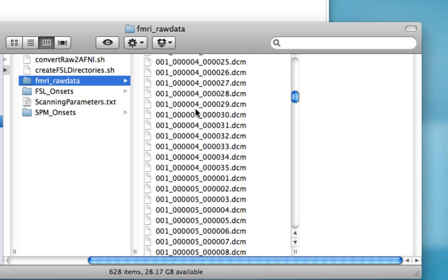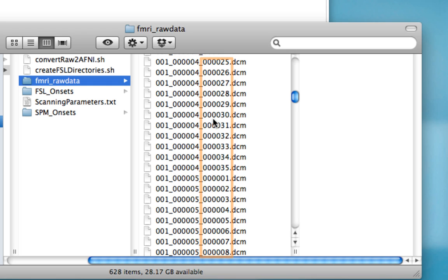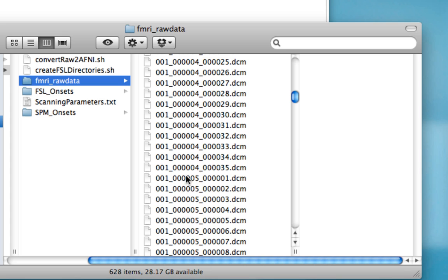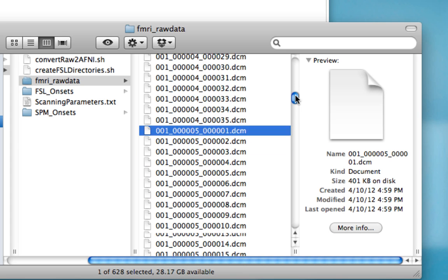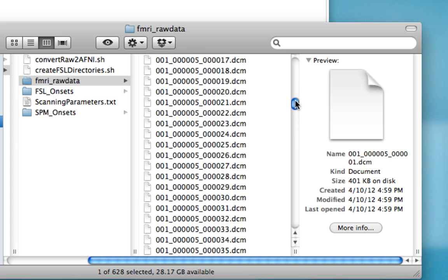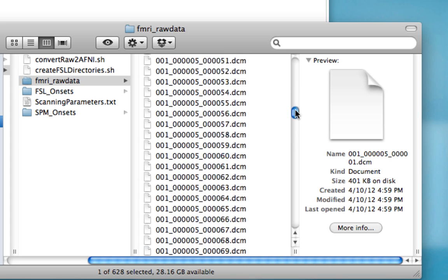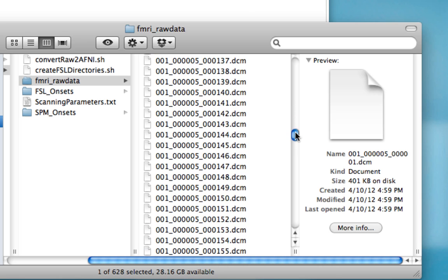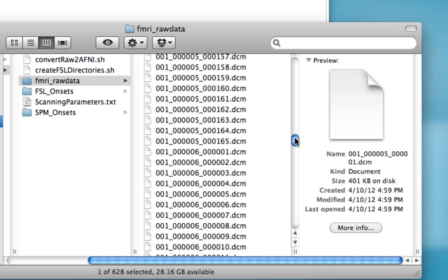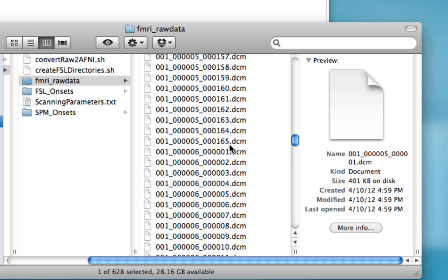The second column here tells you what run you're at, and the third column tells you what image is being acquired. So here we see the start of run five, and if we keep scrolling down, it should end at 165 volumes, and it does.